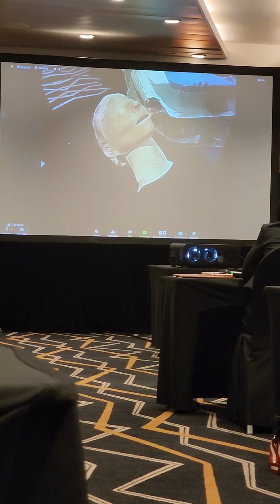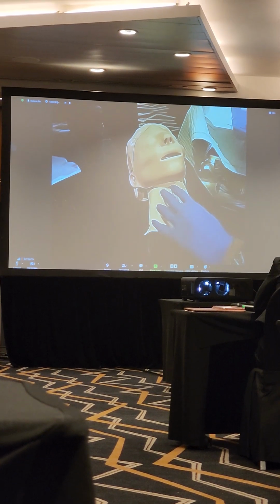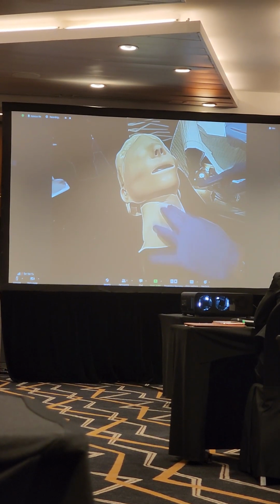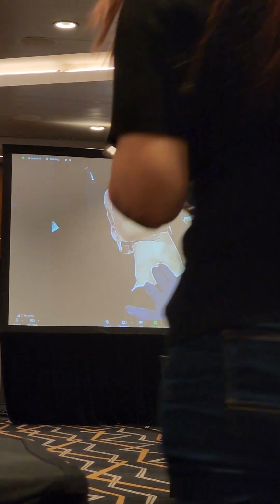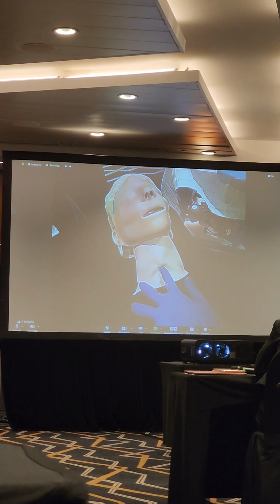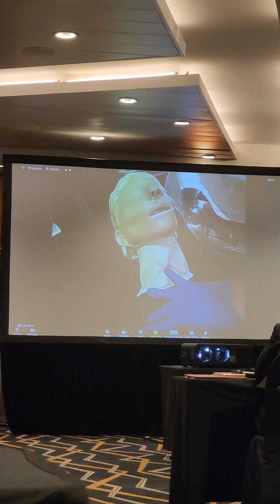So to do it on this mannequin, as you can already tell, the layout is very important. In my left hand, I would have felt the landmarks. This mannequin allows you to feel the hyoid bone, the thyroid, as well as the cricoid prominences. Between the cricoid and thyroid prominences, you would find the cricothyroid membrane. I have already marked out the site over here. So to practice this.